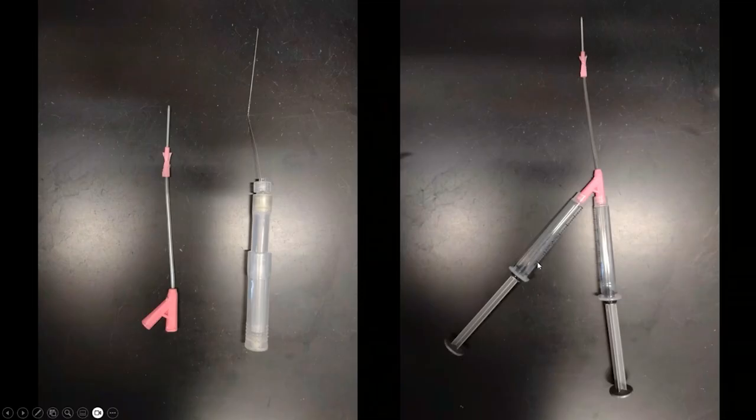I usually use 2 syringes, 3 ml syringes for a mouse, and fill them completely in the event I have some leakage. When I start injecting the agar into the animal, you may not have a perfect seal. You may have some agar coming out the back. It's good to have some backup agarose liquefied, ready to pump in if you need extra. 3 mls should be enough, but if you have some backup extra, that's good.